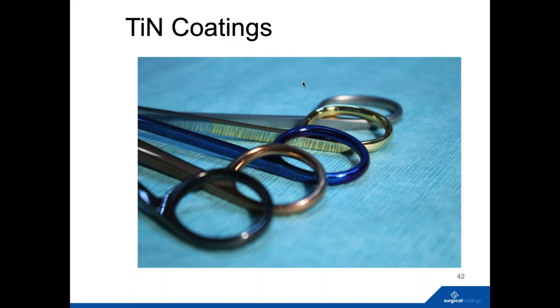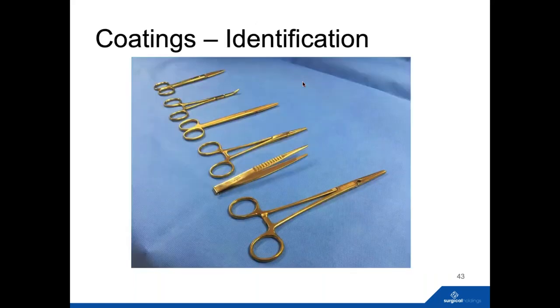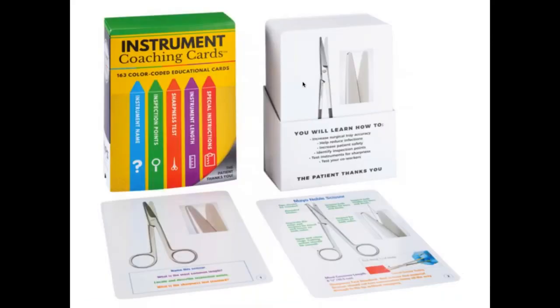But anything that's a little bit more elaborate and has a color on it, I would always ask for information on it to make sure that it's not going to come off when it goes through the wash or sterilization process. And that's what some nice gold titanium nitride instruments look like. This was actually a project we did for identification of those devices to ensure that they separated out a pool of instruments for CJD in the UK. They were for post 97, so that was a coating applied over the top, but that's what that may be if you see that on your trays.